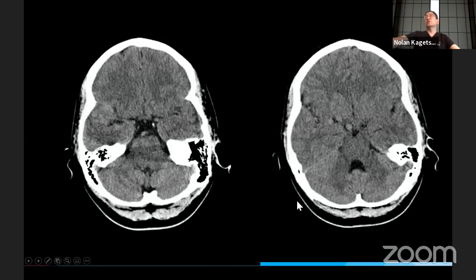Okay, this is a patient that has kind of subtle findings. Let's say it's a patient that showed up with a headache, maybe went to an outpatient clinic, and then came in for outpatient imaging. And the one thing that perhaps is striking is this kind of rounded structure here. And then if you use your imagination, you can see CSF here. Well, first of all, this is a CAT scan. And you can see that there's some asymmetry, right? There's kind of a vague soft tissue here. What do you think that is?